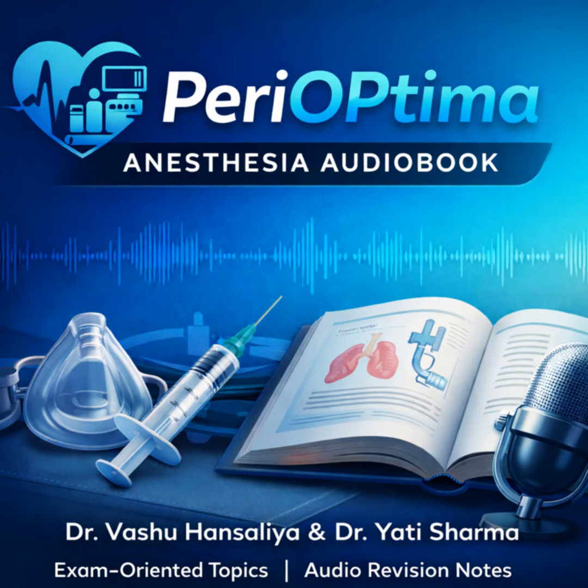Got it. Fourth, we'll analyze vaporizer safety, which is all about accurate delivery of volatile agents and preventing cross-contamination. Fifth, breathing systems safety, managing the integrity, flow, and pressure right at the patient connection. The final step. Almost. And finally, alarm systems, which provide that electronic detection and warning layer over everything else. That's a very clear roadmap.